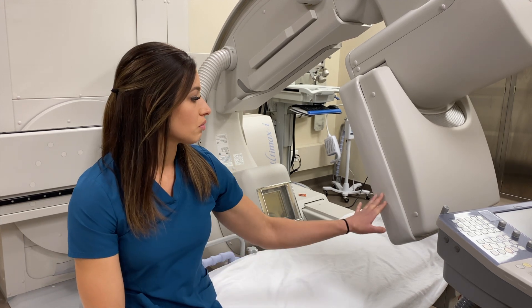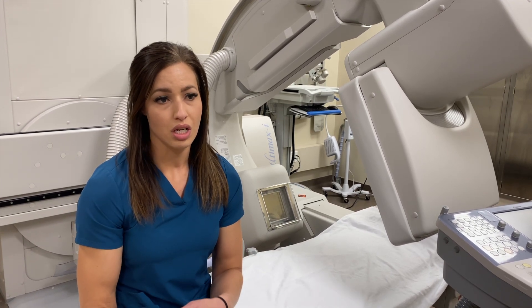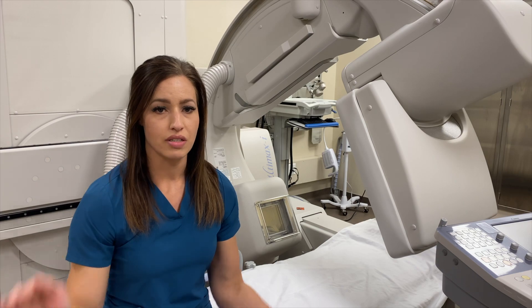With this C-arm that we can do live x-ray with, we can also do real x-rays, and if we need to do post films we don't have to move them to another room to do follow-up x-rays — we can do it right here on the bed. This bed can angle all the way up to 90 degrees either way.